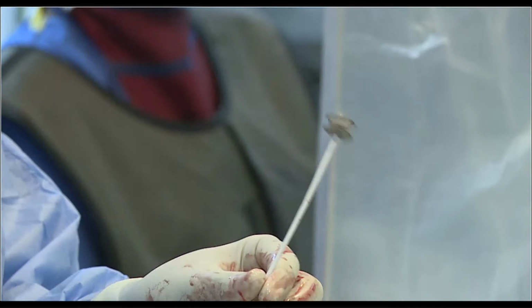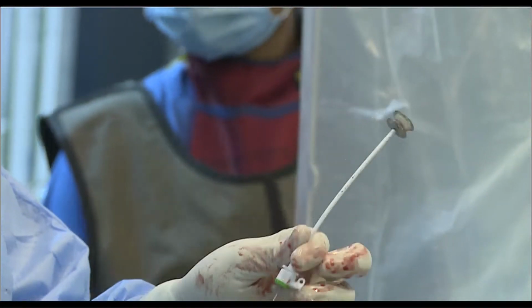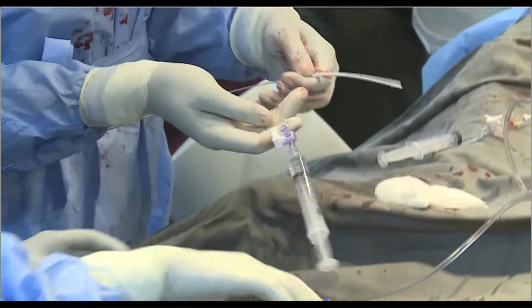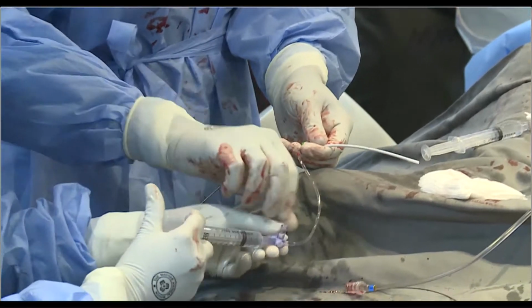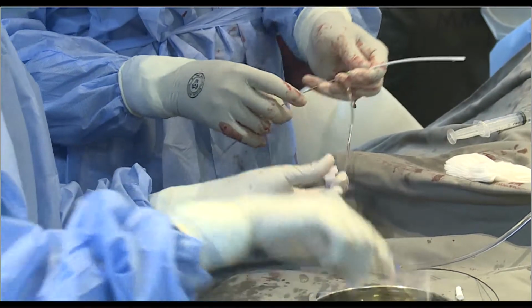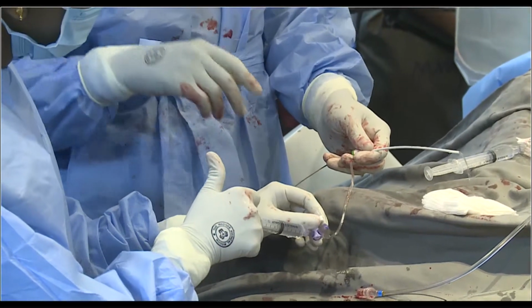It is compatible through a 6 French sheath. You can see that this is a 6 French loader, and now we are going to take this device, flush it. I have right now loaded a 14-12, but I can change over to a 12-10.